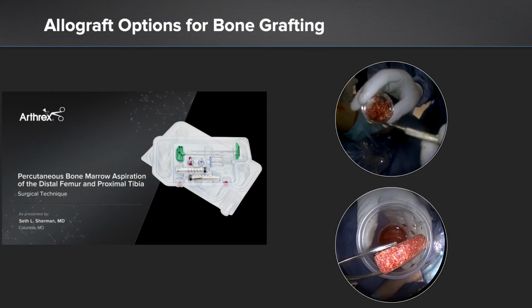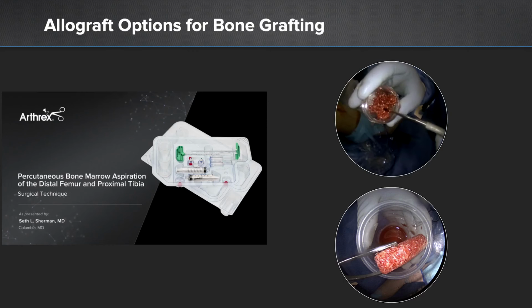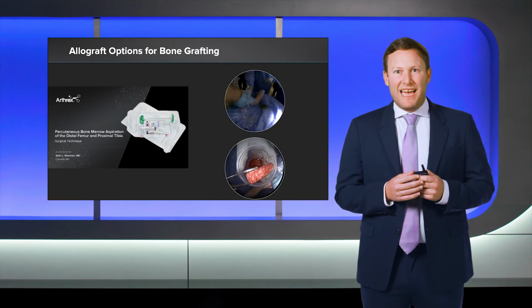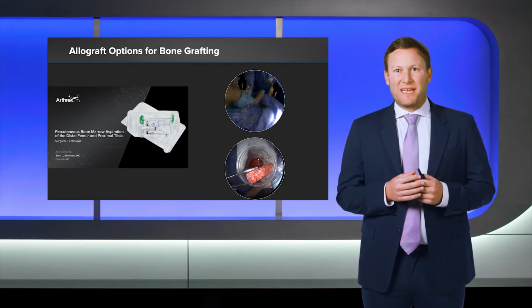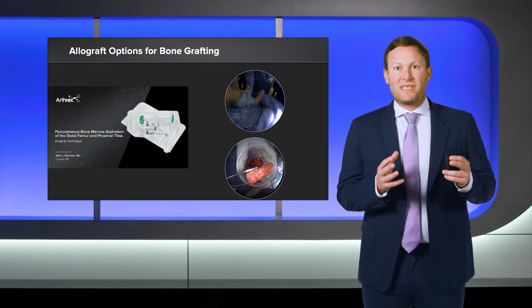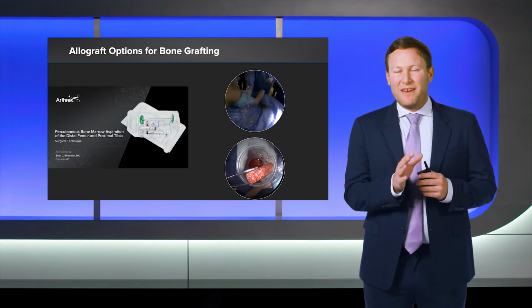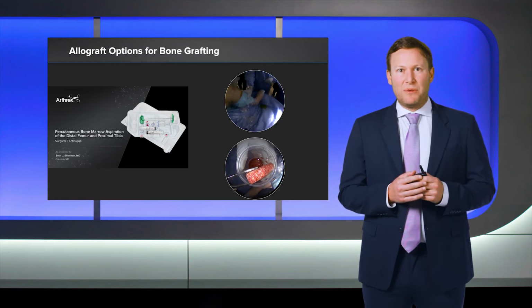We have a separate video showing ways that we can take bone marrow aspirate from the distal femur and/or the proximal tibia, or of course, if it's your preference, you can go upwards towards the hip. I think it is also helpful to consider, as we see on the far right, mixing AlloSync Pure with bone marrow aspirate concentrate. If there are any gaps in your bone grafting or severe enlargement of tunnels, even larger than our biggest dowels, then we can fill those gaps and seal the apertures more precisely using this AlloSync Pure mixture.